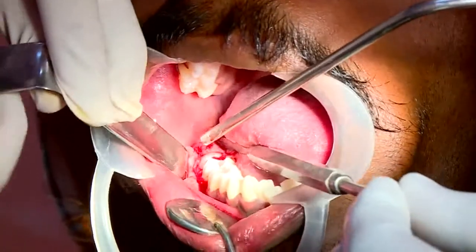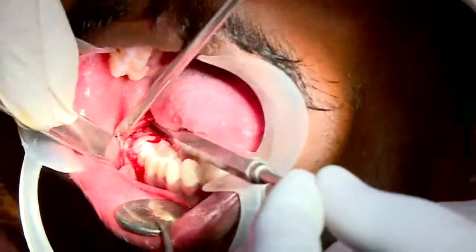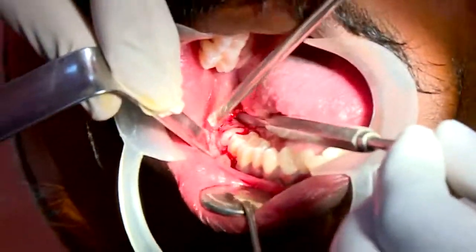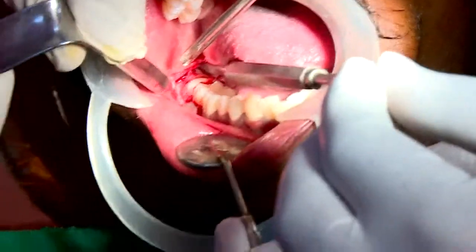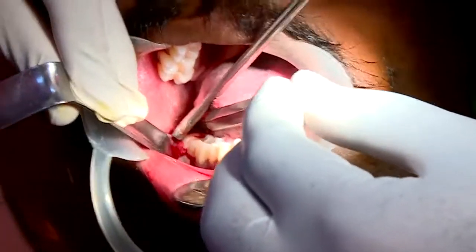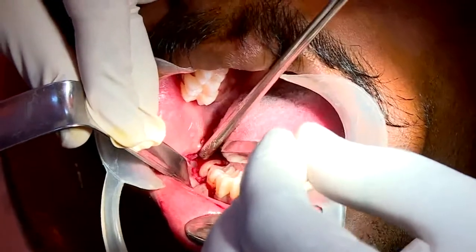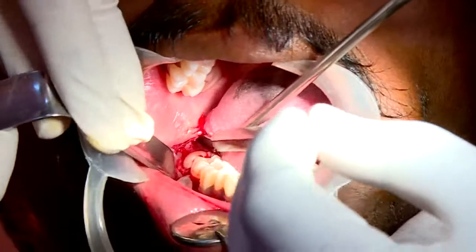You can put it there like that, subperiosteal, and it will stay there most of the time. So this gives protection for the lingual nerve, which is very important. Otherwise the patient is going to complain of paresthesia of the tongue and here, 2/3.